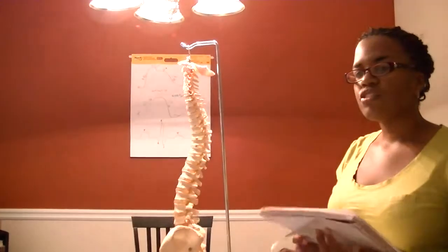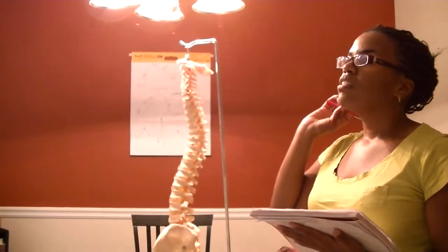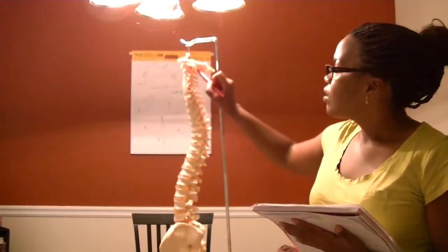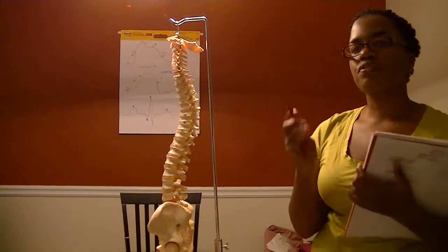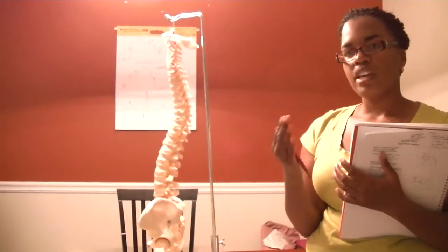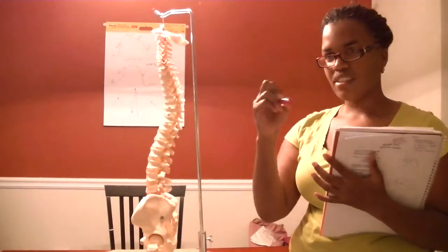Okay? Extension is just the opposite. So in extension, they should come together. It shouldn't look the same as the regular lateral view. It'll be shown as a smooth line yet again. Okay? And on a test, since we can't do a flexion and extension study, what we'll do is just look for the V-like indentation between occiput and atlas. So if she puts up a film and she says, is this an occipitalization? We know if there's an indentation, then there's no occipitalization.